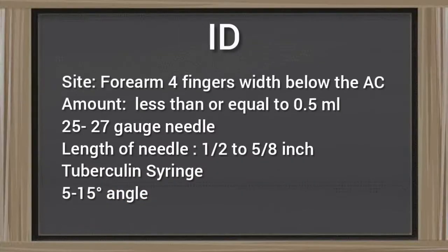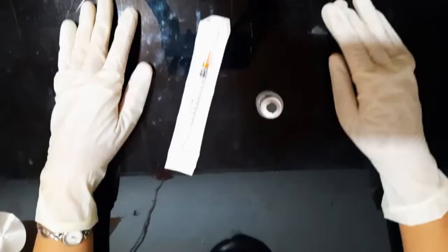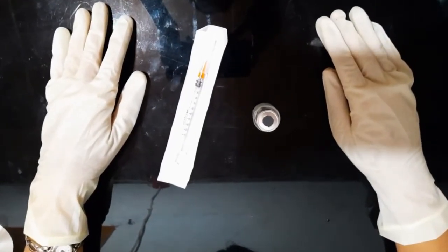And today, I am going to perform administering parenteral medication, which is the intradermal injection. Now that we know about it, let's actually do it. Wash your hands, provide privacy, verify patient with name and the date of birth, do our 3 checks, and our 6 rights. Our 6 rights are right patient, right medication, right dose, right time, right route, and right documentation. Now we're ready to draw up our ID injection.